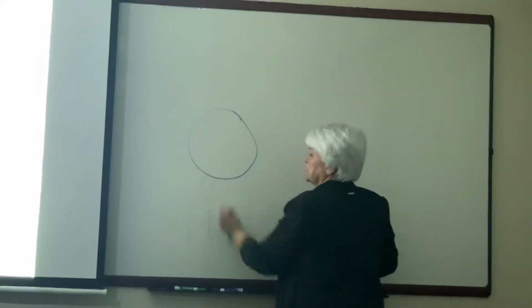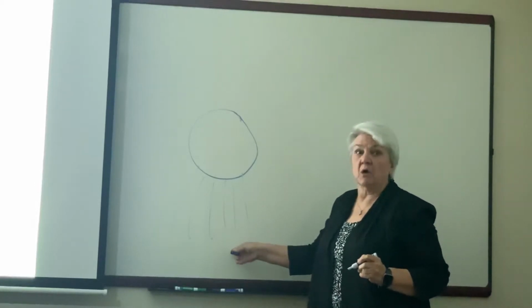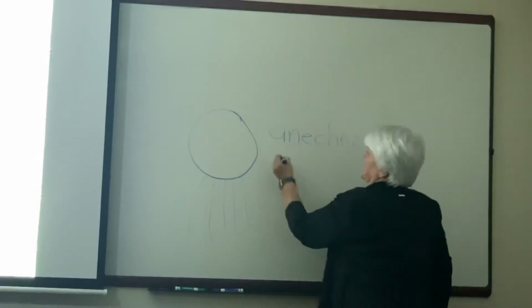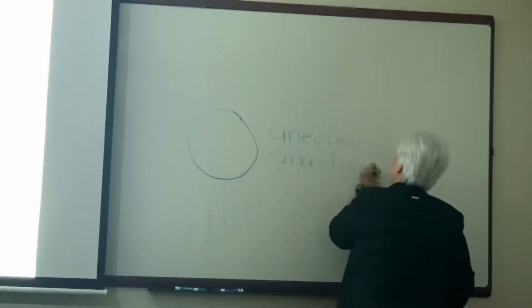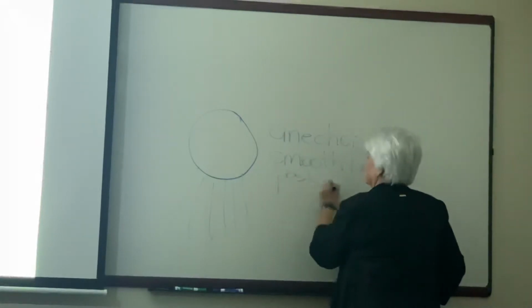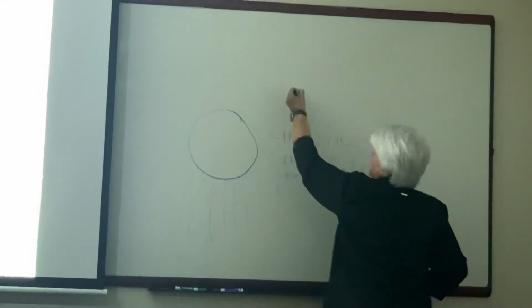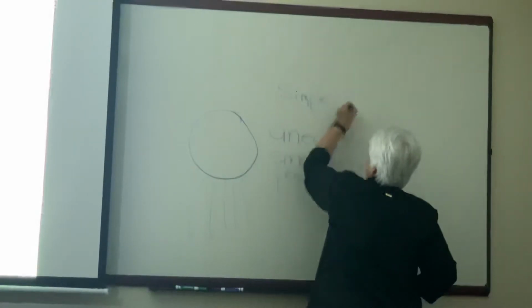It's going to have posterior enhancement, so it's going to be bright behind, or posterior to, the cyst. It has to be anechoic. Smooth borders. Posterior enhancement. Okay, that is a simple cyst.